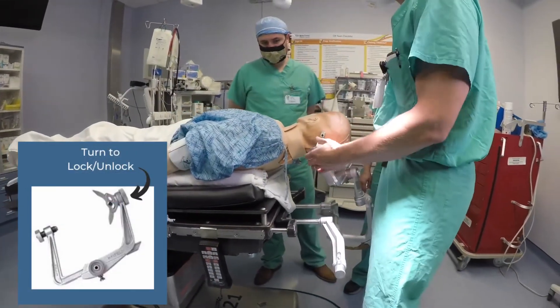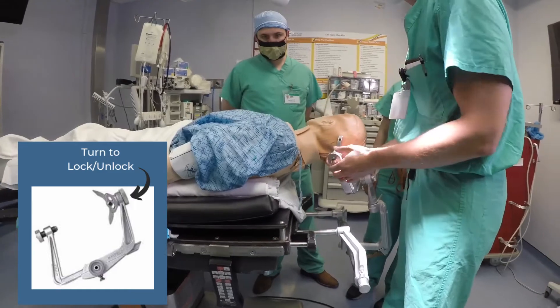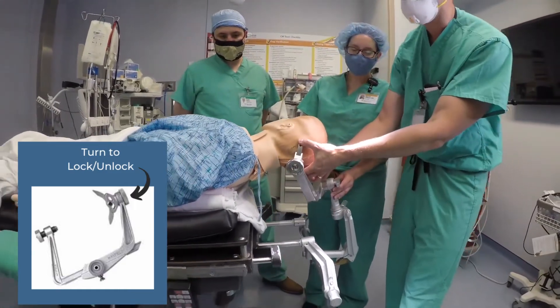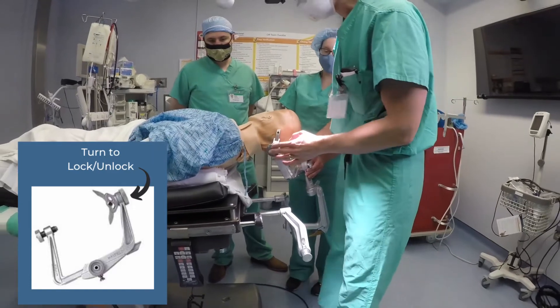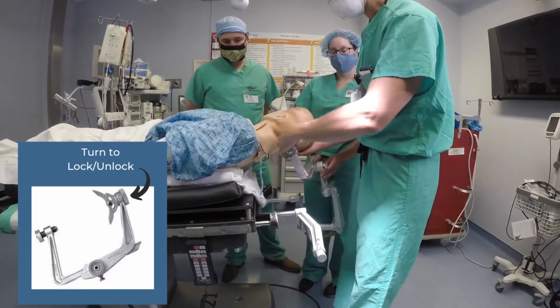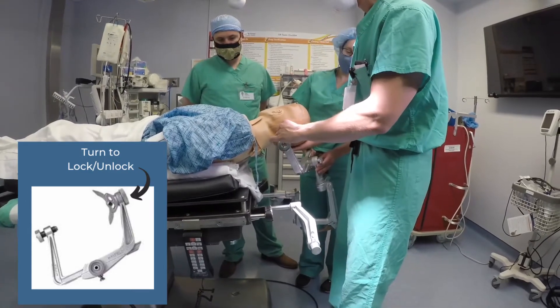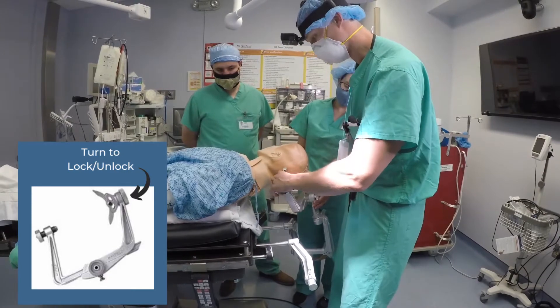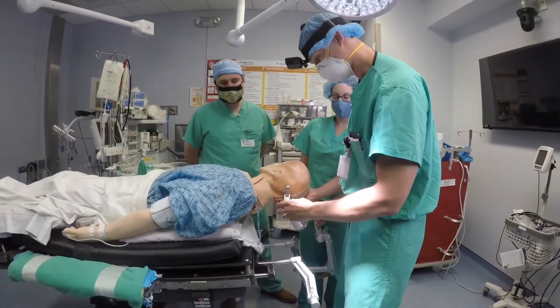One important feature is the lock-unlock mechanism. The head rocker — the two prongs usually in the back — should be maintained in the locked position whenever possible. When unlocked, it can move freely, which can facilitate pinning at a different angle, but once the pins are in, you usually want them locked to maintain better control of the head.